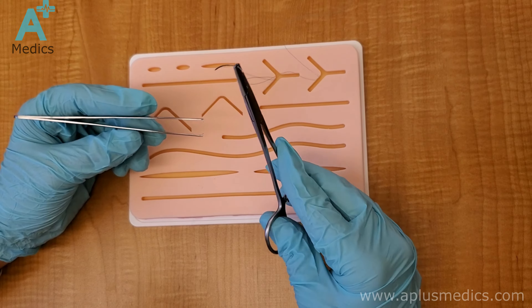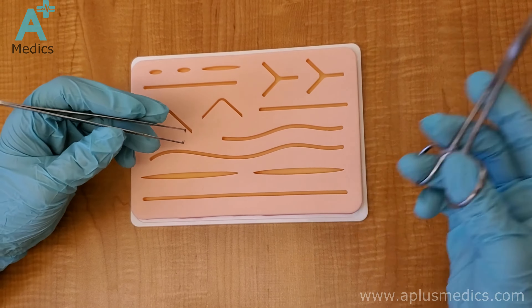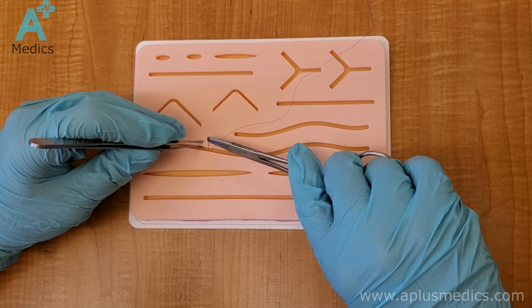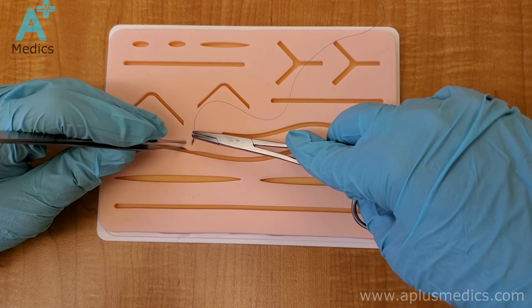All right, so now I'm going to demonstrate how to do a surgeon's knot. Surgeon's knots are useful because they provide extra tension in approximating the edges of the wound.